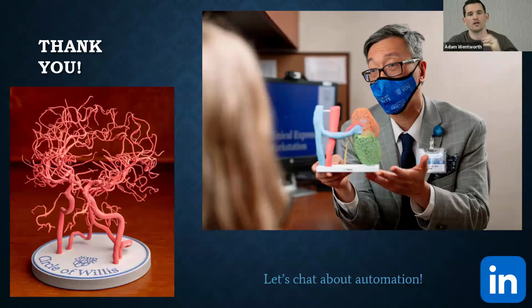We have the script for preparing models for the statistical shape modeling. We will check if certain parts are outside certain bounds of a surface area to volume ratio. And that would indicate to us that there may be segmentation errors with that model.